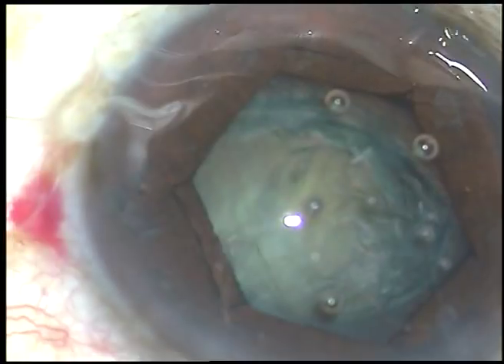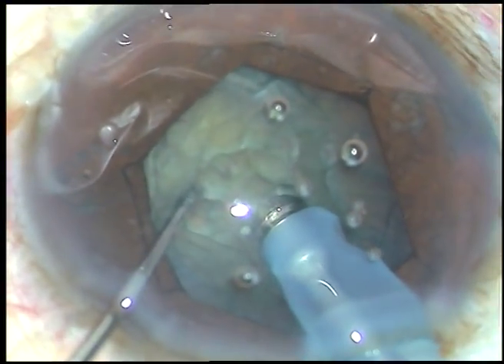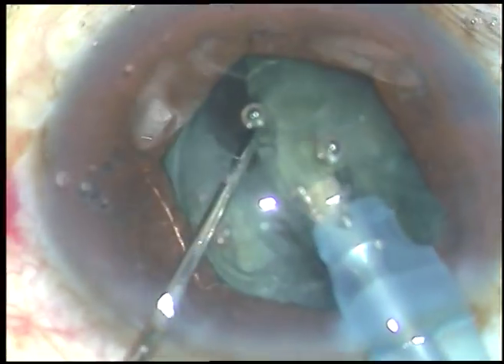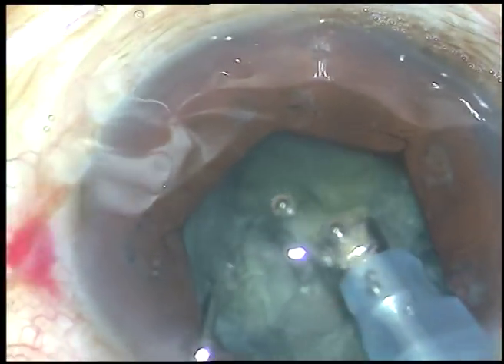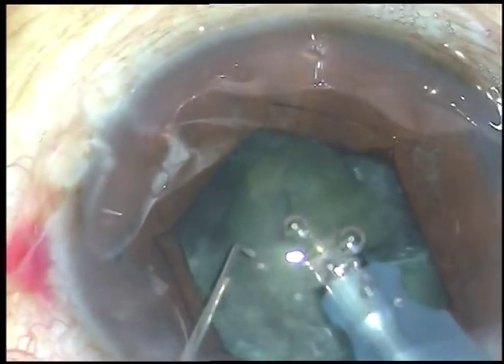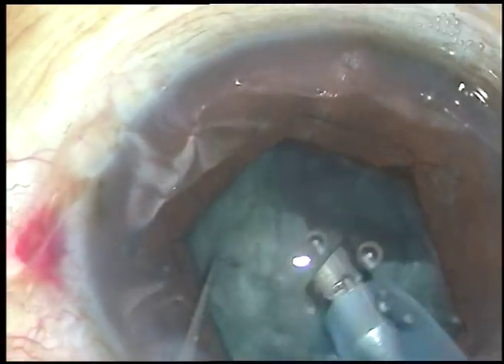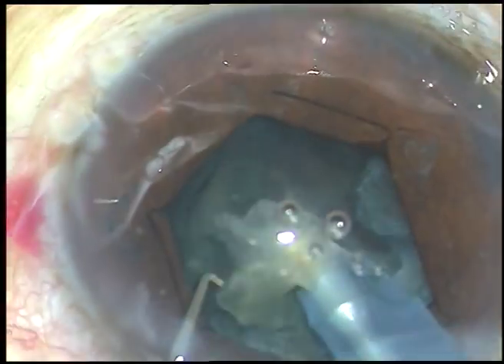The nucleus is rotated and now is the time to introduce the tip of the phaco handpiece. See, the patient is constantly moving his eye. Topical anesthesia with the BX pupil expansion device is possible because the iris doesn't have pain sensation — it is the ciliary body that has pain sensation. So if you touch the iris, the patient is not going to feel pain. Only anterior chamber fluctuations or stimulation of the sensory nerves on the ciliary body will cause pain, otherwise not.